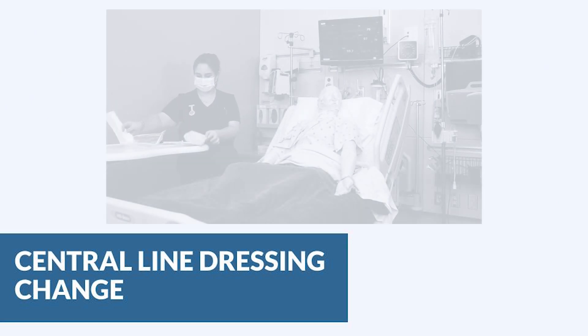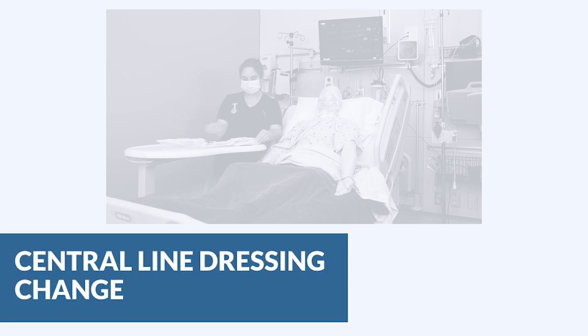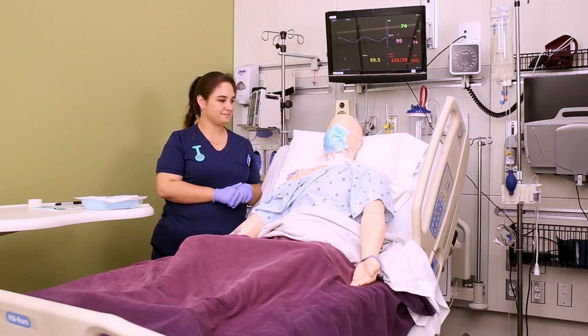In this video we're going to talk about central line dressing changes. We're going to look at a central line on the subclavian vein, but the same strategy is also used for a PICC line in the arm. Remember, the dressing should be changed every seven days or as needed.